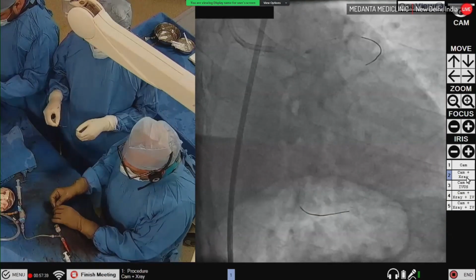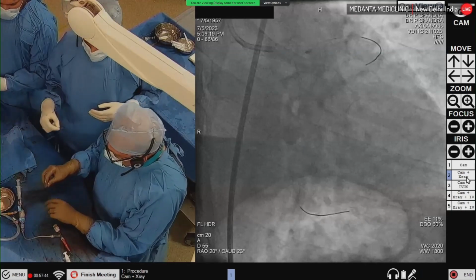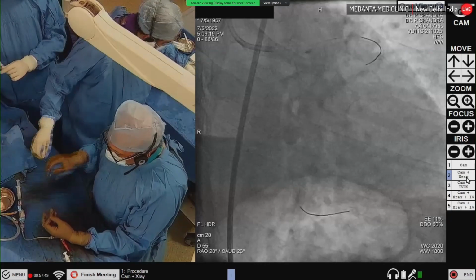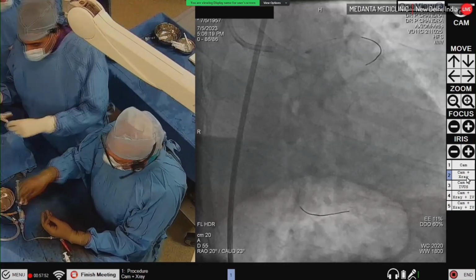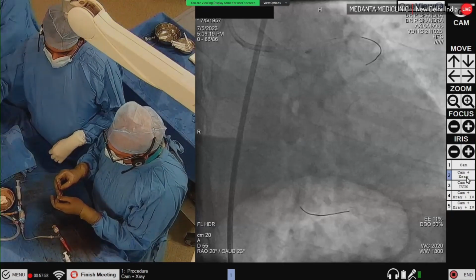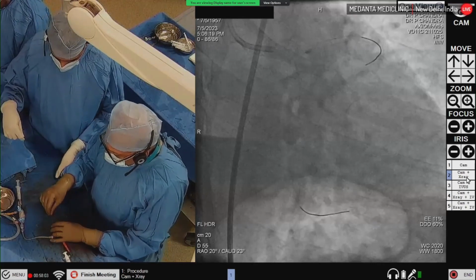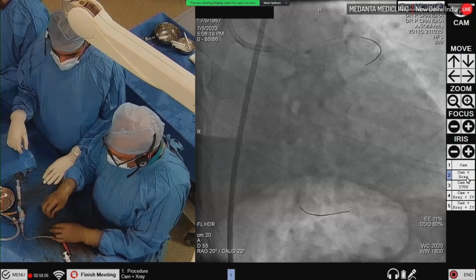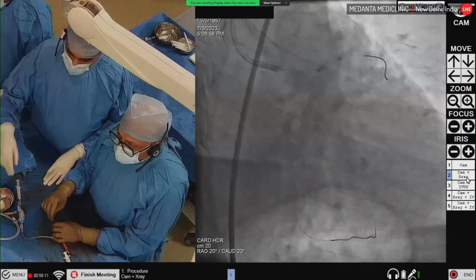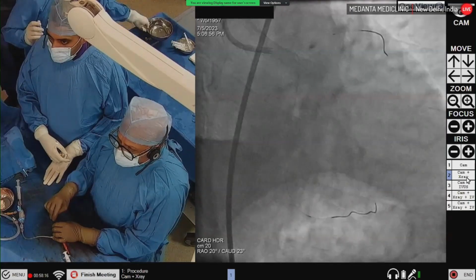Okay, so we have a 2 millimeter balloon. So we take that to score flex. Yeah, this is a score flex. Give me the score flex 2 millimeters for pre-dilatation. And then we can see how it moves inside. Typically, a score flex is a balloon which can cross easily, but of course, the cutting effect sometimes may not be adequate. So we will see. Sometimes we have more dissections also. But anyway, I think this is a good balloon for pre-dilatation.